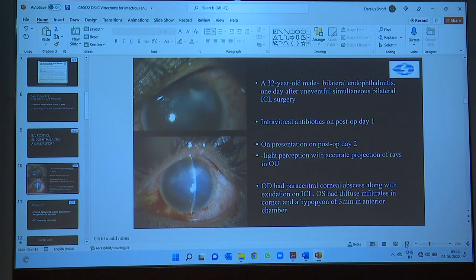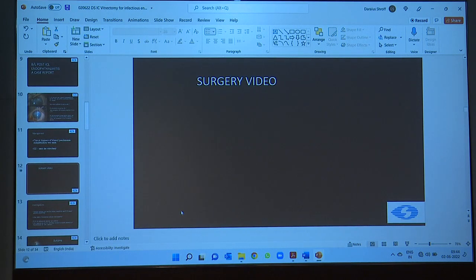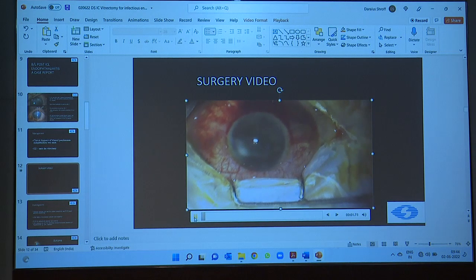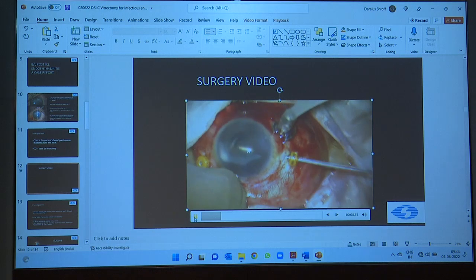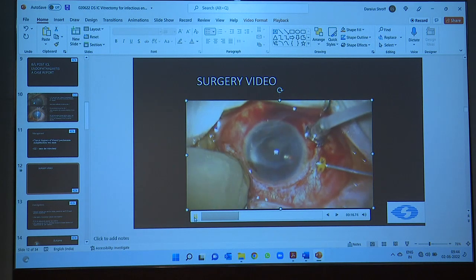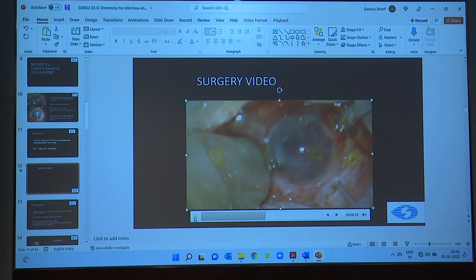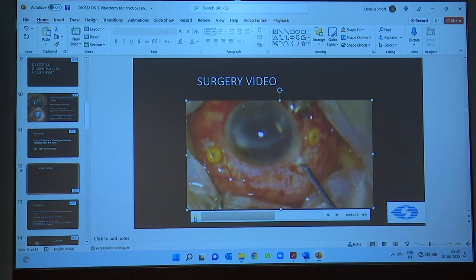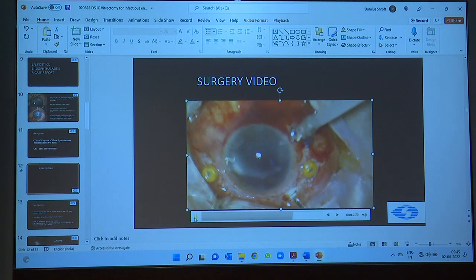Because it was very severe, we decided to do a lensectomy. We found a lot of muck around the ICL with fibrinous exudates. We needed to mobilize and remove the ICL because without it the view of the posterior segment was very poor. Thinking out of the box, we made an additional sclerotomy with a 20-gauge port and used the 19-gauge IOFB forceps — the kind used in the old days — and removed the ICL through this port so we didn't have to touch the cornea.